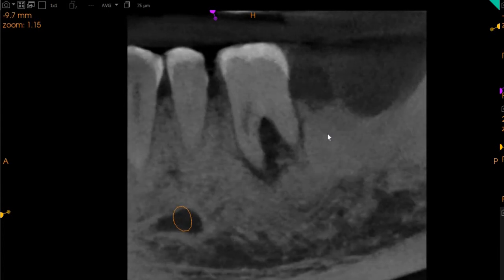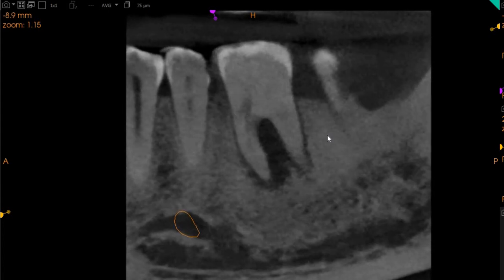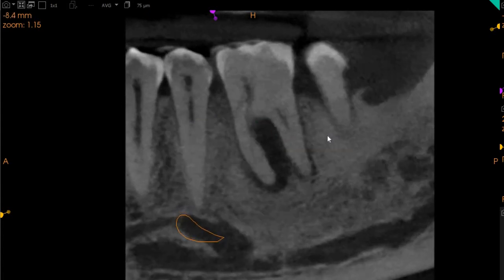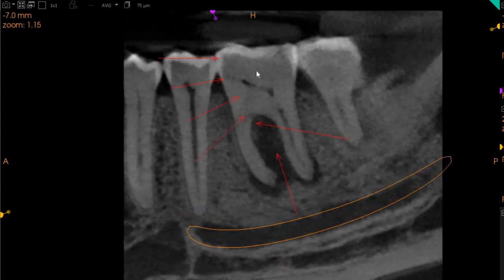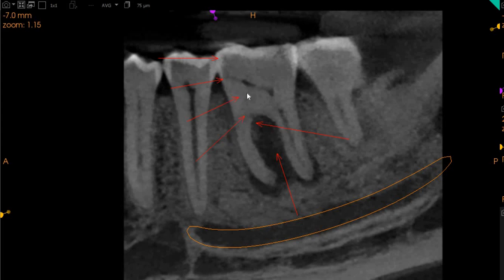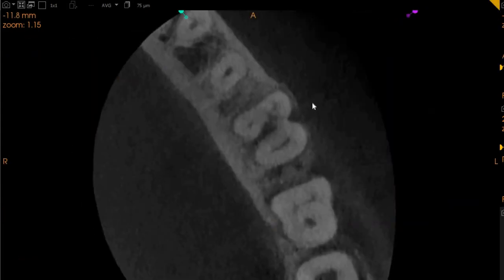Moving to the middle of the tooth where the furcation is, we can also see another line of crack. We have marked at different intervals where the crack can be seen extending into the inter-radicular area. Again here is a J-shaped radiolucency, and here the crack is very clearly visible.